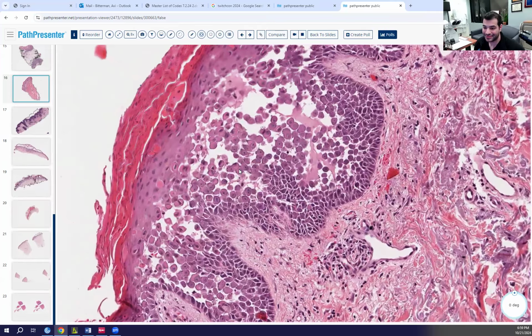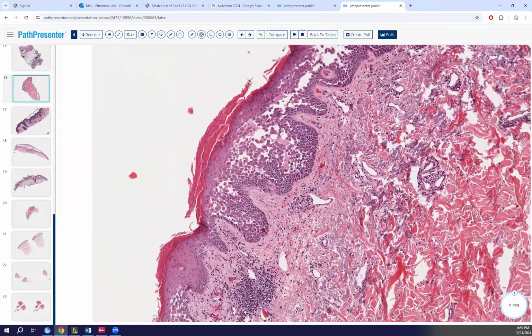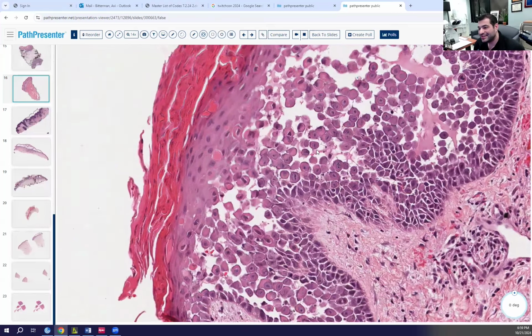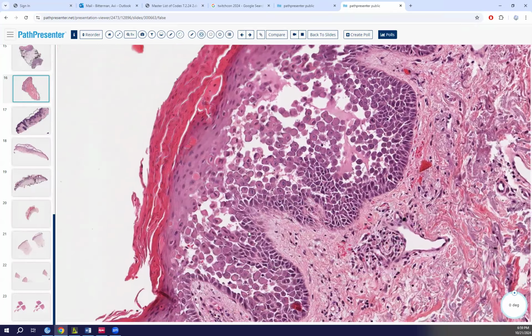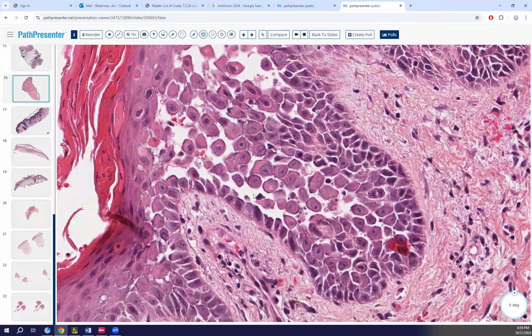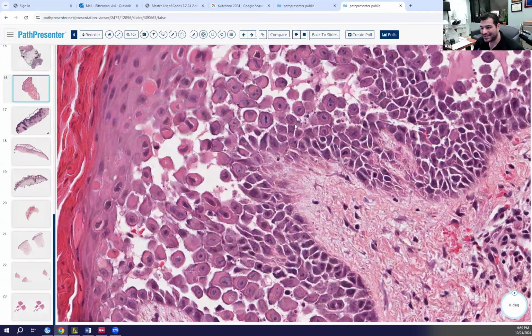What's this? Punch, superficial perivascular infiltrate, with... oh, this is HSV? Do you think these are viral changes? Yeah, it looks viral. Well, what are we looking for as viral changes of HSV? The 3 M's. Which are? Margination. Multinucleation, margination, and molding, right? Are any of them present? Do we see those here?